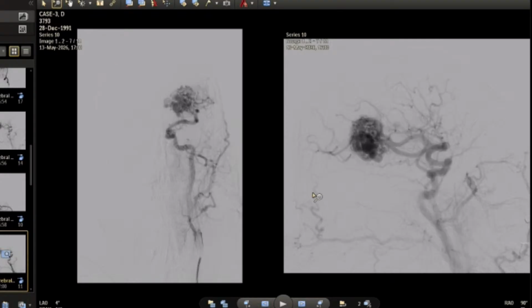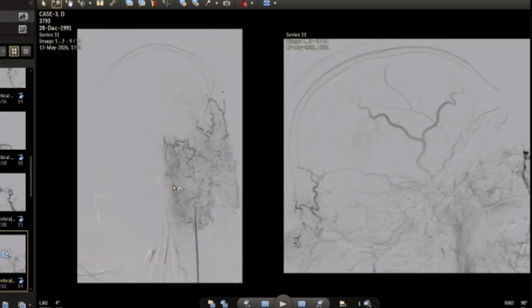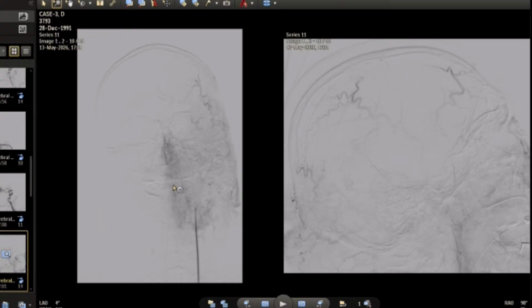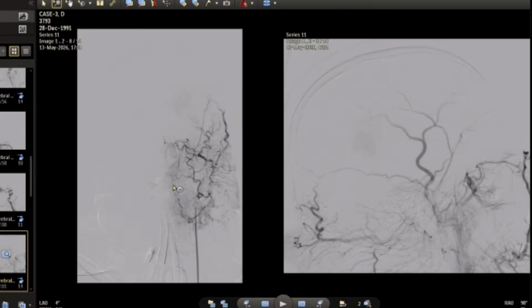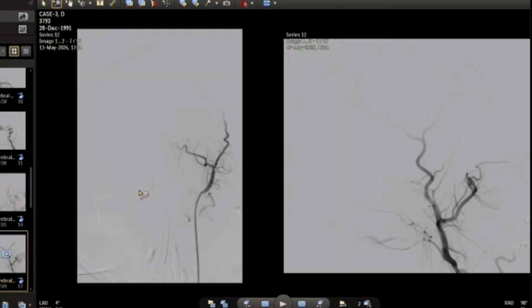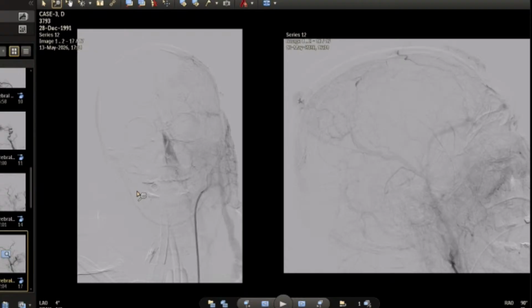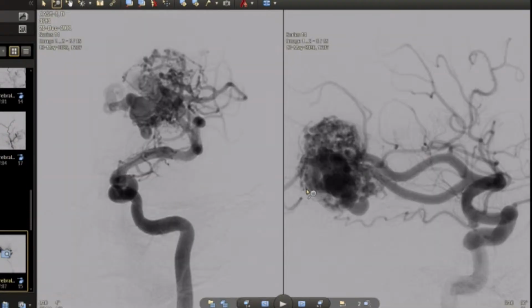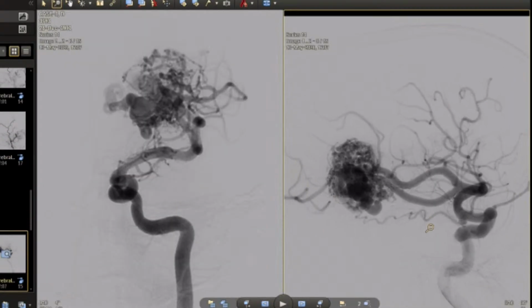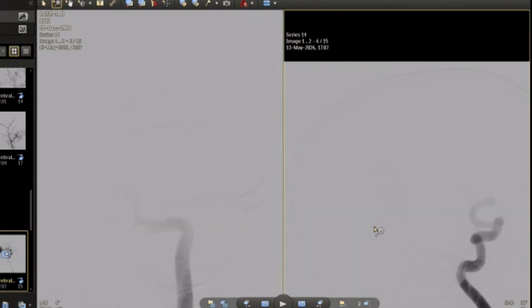Meningeal might be connected. Okay, Davlet made the angiography more selectively. No, it's not connected. Okay, it's nice. Then we should work only with the intracranial circulation. The choroidal, distal MCA.